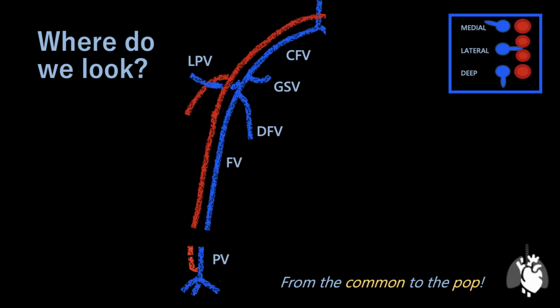When I start, I orient myself by finding the superior medial approach of the greater saphenous vein. Then I follow the common femoral vein as proximal as possible into the inguinal fold. Then I start compressing at this point, the point that's most proximal, and work distally by compressing every 1 to 2 centimeters. You must be very careful to ensure complete closure of each point, especially at each of the venous junctions.